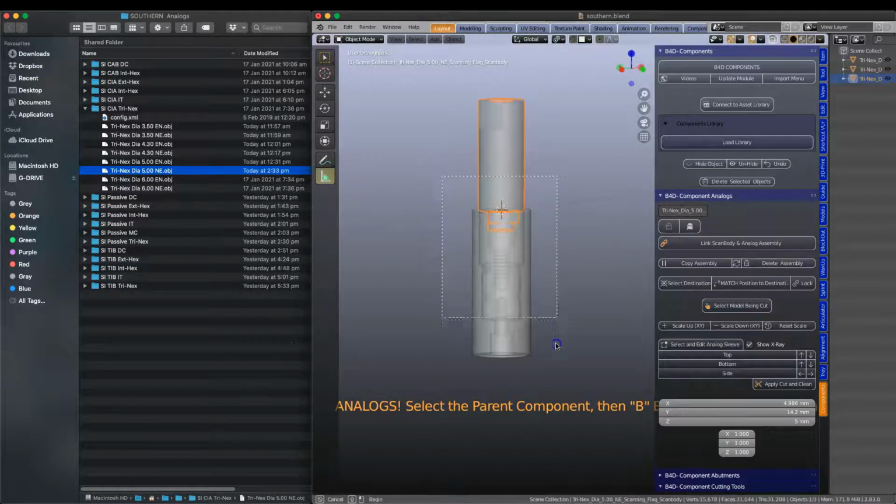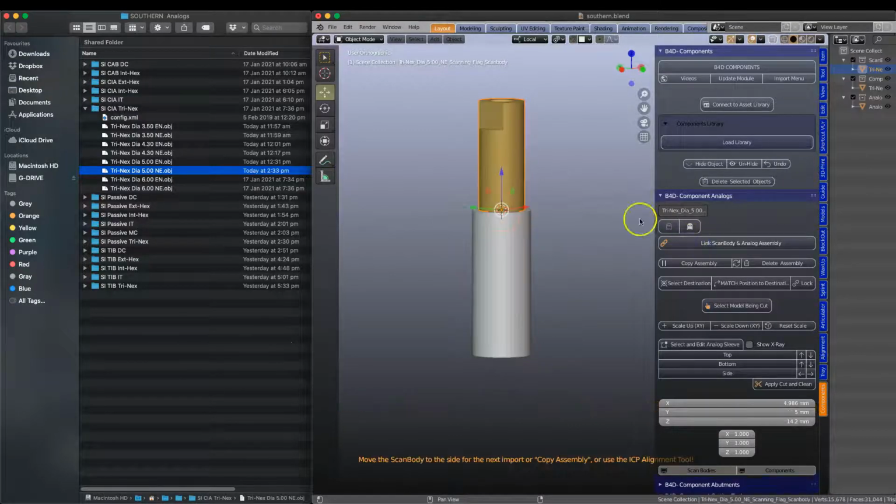Using the B key, select all the other parts that are associated with the ScanBody, link it. Now you see the ScanBody being yellow. Of course we can push G and we can move it around. The ScanBody is a parent, the others are the children. Where the parent goes, the children will follow in Blender terminology.